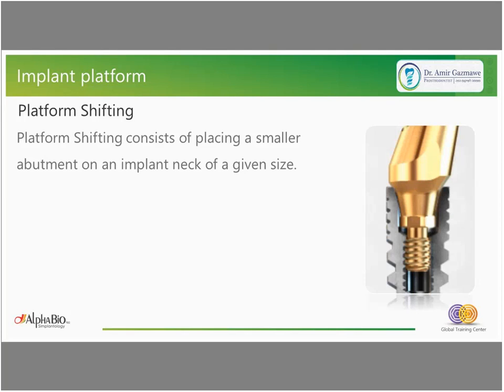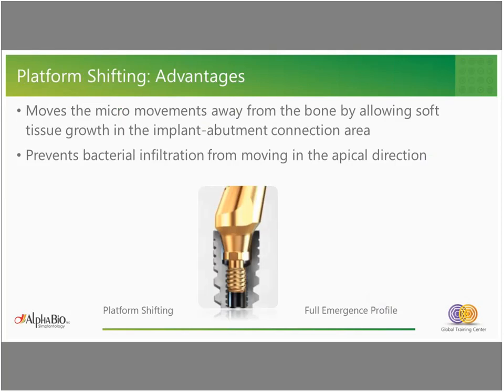The advantage of this conical connection can also be seen in the aesthetic area, where we can use these specific abutments to have a good emergence profile, especially when we have limited width of restoration.